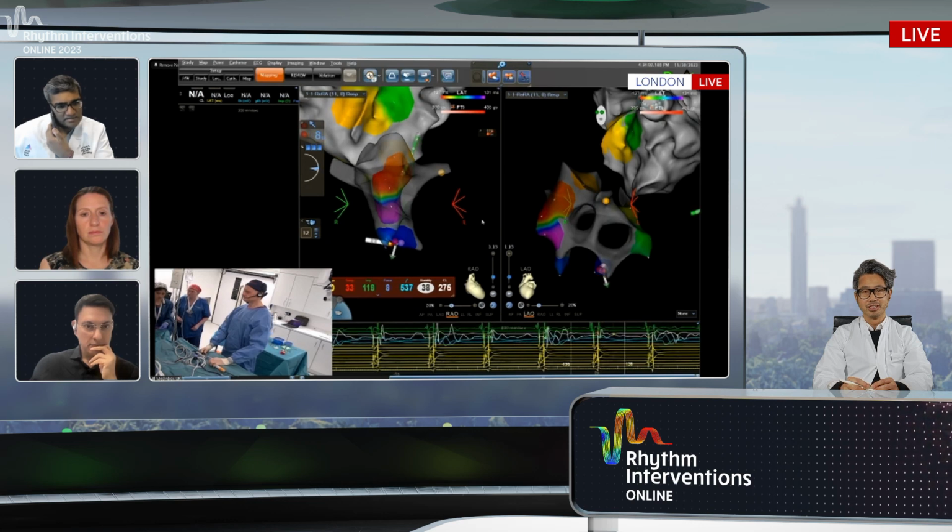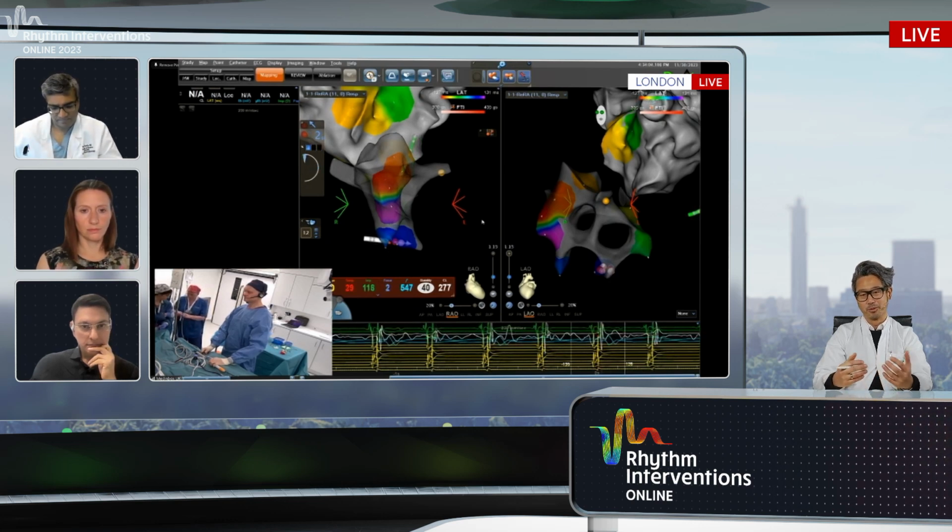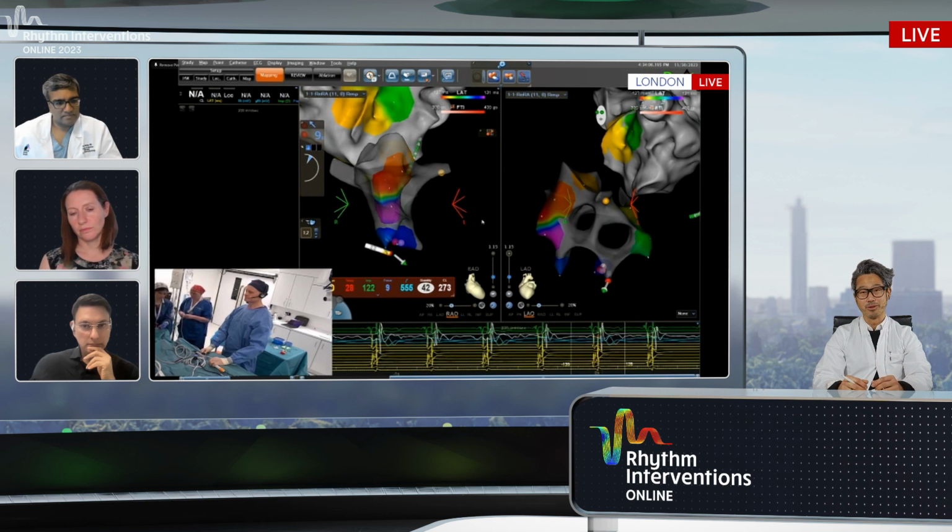Yeah, Richard, I'm also supporting your approach with the point by point. I have to admit that in Frankfurt in our center, despite all the great technologies with high density maps and creating a super beautiful couple of thousand points, we still like to have the clear-cut information from maybe 100 points. If those are very clear and clearly understood, they are also very helpful.